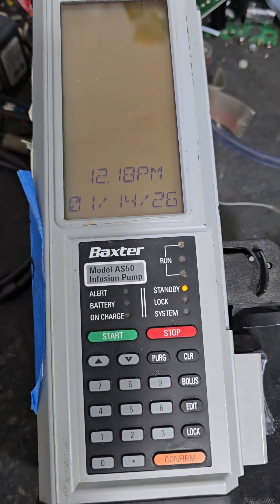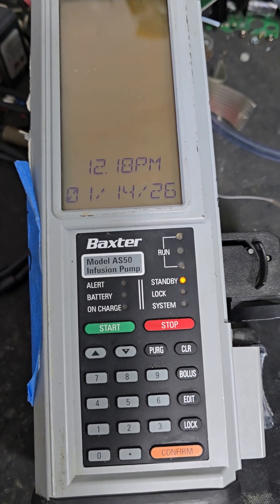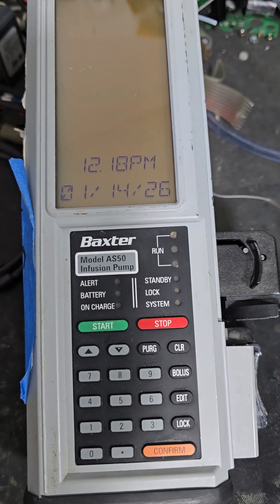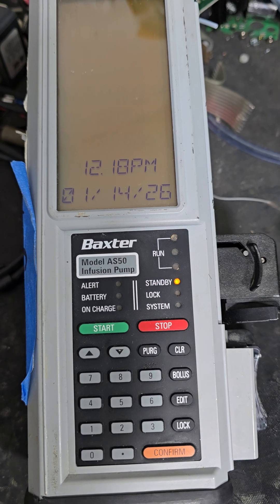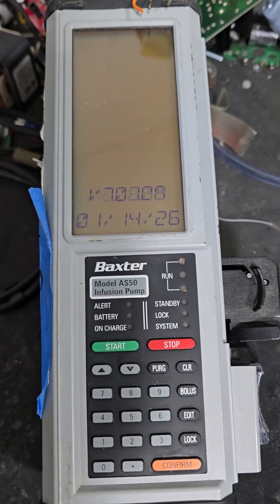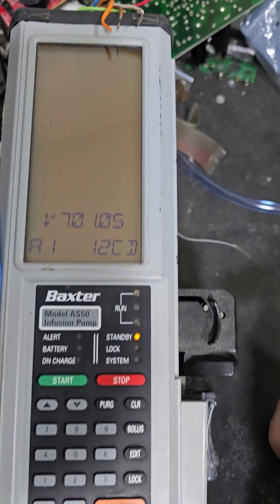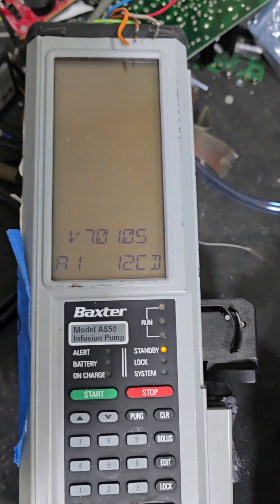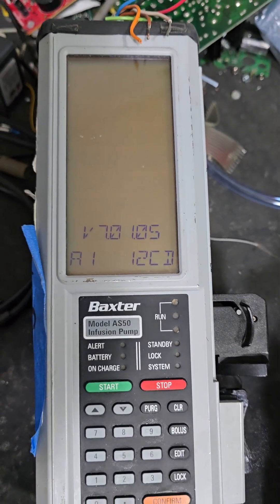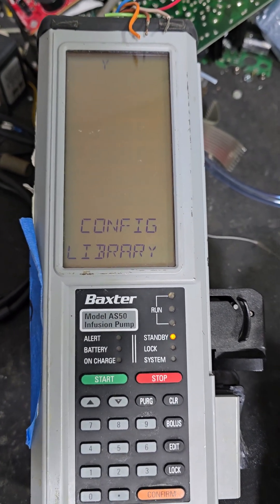There's your date. Next will be your software revision. And then the next screen is where you can start going through stuff.